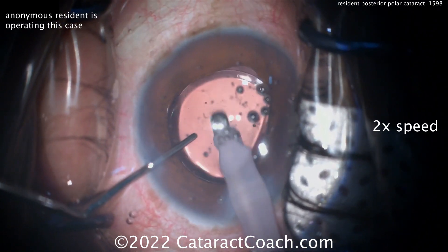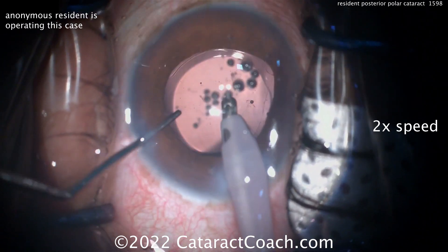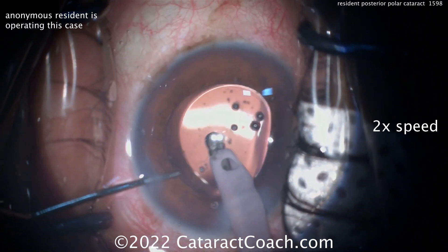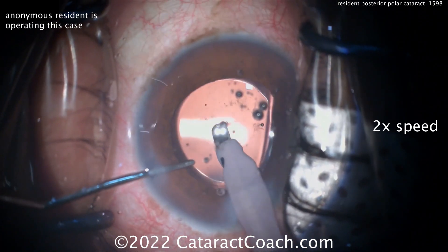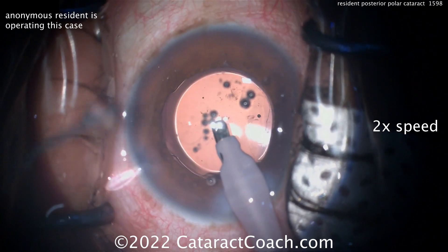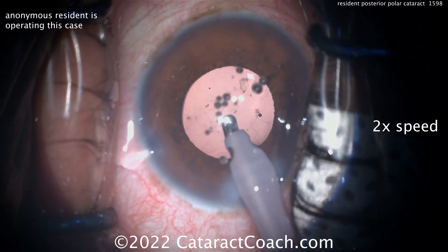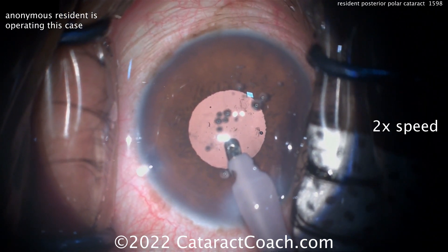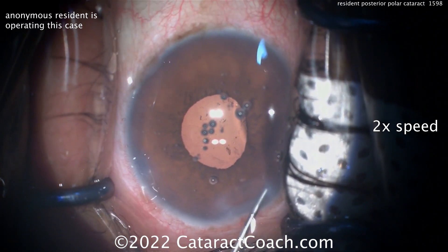Now cleaning up the viscoelastic. In a case like this, I'd be very cautious — even a little hesitant — about going behind the posterior capsule, because you want to just get out of town now. Your surgery is over, the lens is in the bag, the posterior capsule's intact — let's leave well enough alone and get out of this eye. Not letting the anterior chamber collapse: BSS in the second hand, inject and keep coming out of the eye quickly, then quickly seal up and hydrate those incisions. I would hydrate the main incision prior to putting the IA probe in the eye to remove viscoelastic.